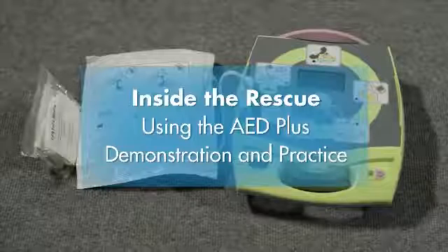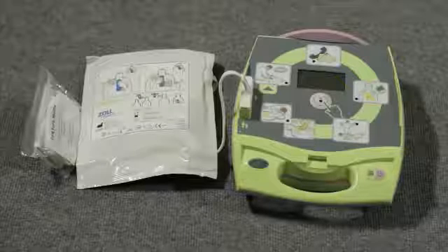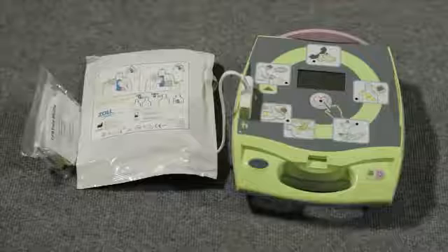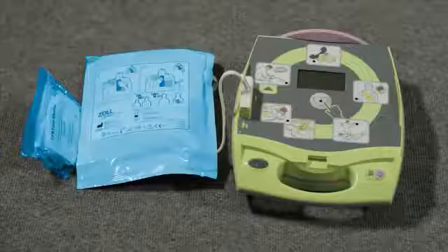Demonstration and practice. An AED is used to correct or restart a person's heart rhythm. AEDs can be used for adults and children. Like all AEDs, Zoll's AED Plus has a start button, voice prompts, a shock button, and electrode pads.